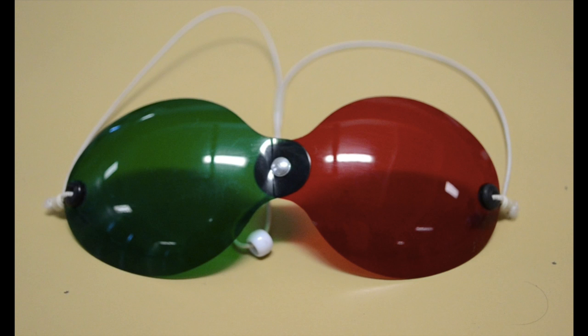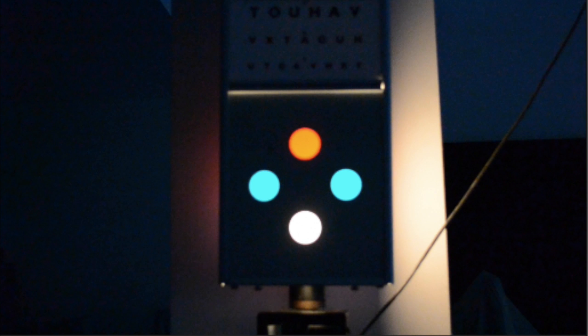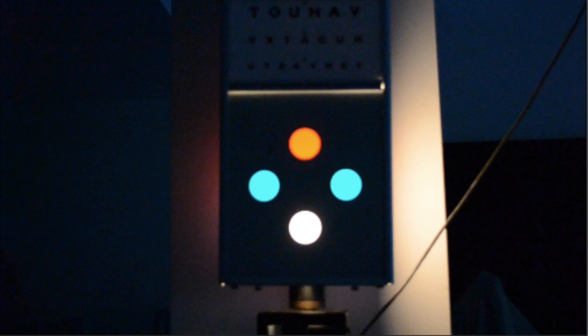The test requires the use of red-green dissociative goggles and a specifically designed illuminated apparatus, which contains four lights in a diamond configuration, consisting of a red light, two green lights, and a non-filtered white light, arranged as shown.